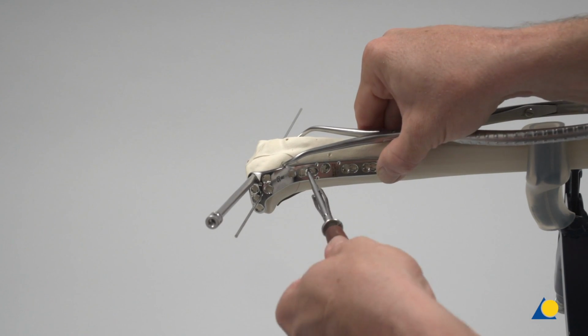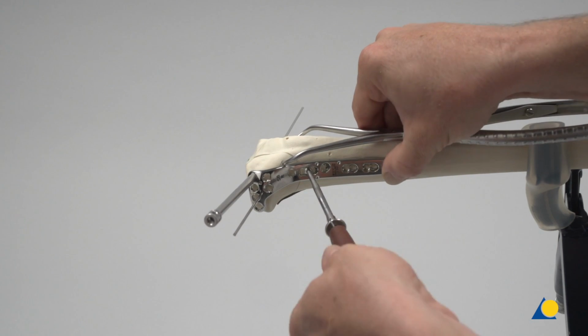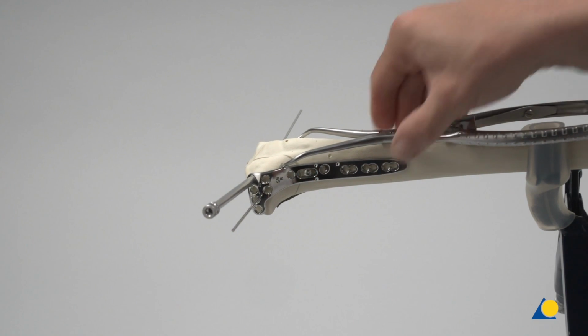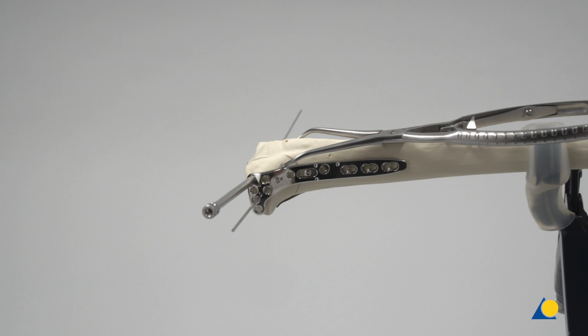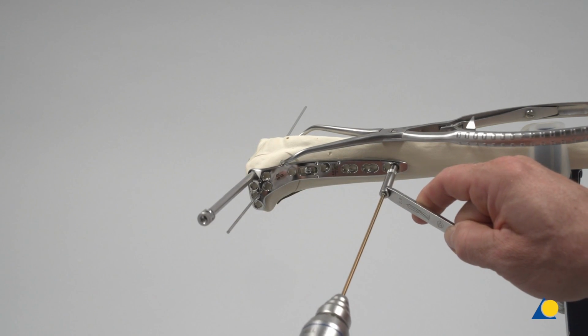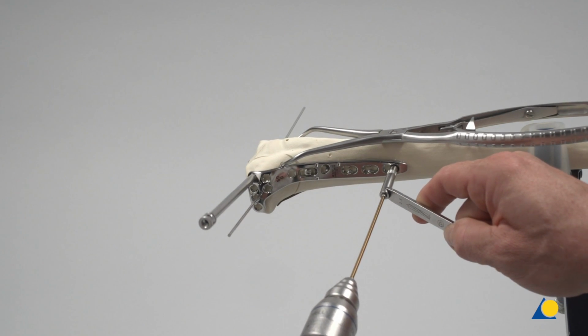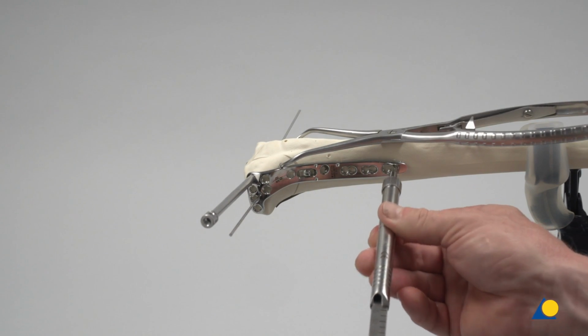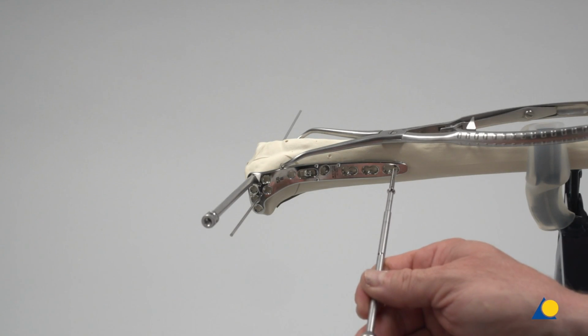Note that when using a plate with 12 or more holes clinically, the superficial peroneal nerve and anterior neurovascular bundle must be carefully protected. The plate must be correctly aligned before continuing with screw insertion at the distal end of the plate. Clinically, intraoperative imaging in both the AP and lateral views would be performed to verify that the plate is correctly aligned. The screw insertion steps are repeated at the most distal end of the plate and here a 3.5 mm cortex screw is inserted.